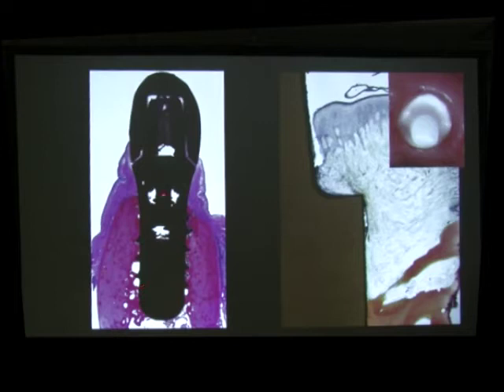This is a titanium implant. In the beginning, titanium implants used to be placed so that only the surface treatment area was placed inside the bone, and then there was always what we called a transgingival portion. This transgingival portion gave health to the gum because, if this was a cemented prosthesis, the cement would not be placed too close to the bone. So these were the most stable type of implants, and the only inconvenience is that in very thin gums, the grayness of the implant would show through, or if there was a recession, patients would complain that part of the transgingival portion was visible.